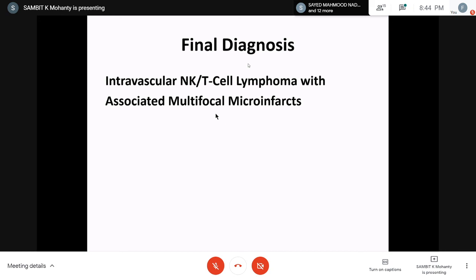What is the opinion on core biopsies, Pulkit? Are you very comfortable with core biopsies? Yeah, sometimes when we have a straightforward defining marker on our core biopsy, we do give a diagnosis, but especially in cases of T cell lymphomas, or the DD between reactive lymphadenitis versus a T cell lymphoma versus a T cell rich B cell lymphoma, we get stuck, and then we correlate, discuss in the lymphoma rounds, and ask for some more samples.